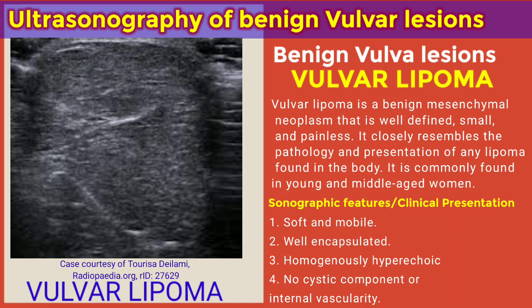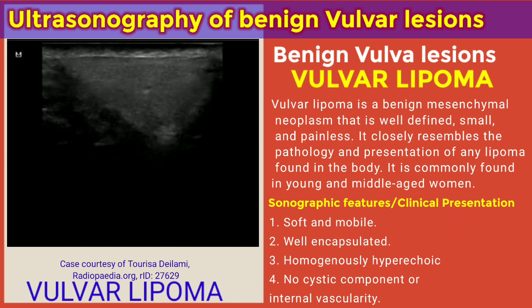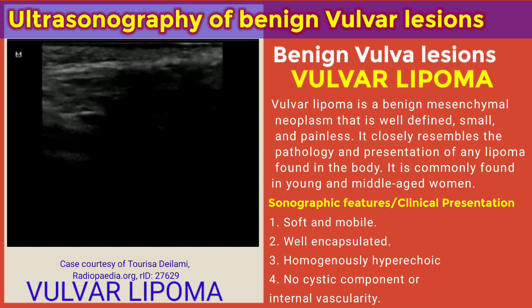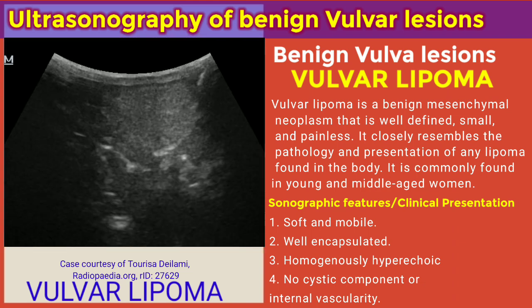The sonographic features include a well-defined, homogeneously hyperechoic mass — as we can see in this video — which may be oval in shape. On color Doppler interrogation, no flow is indicated. When physically examining a woman with vulva lipoma, you will see a vulva bump that is painless, mobile on compression, and very soft on palpation. Sonographic features remain the homogeneously hyperechoic mass without flow on color Doppler interrogation.